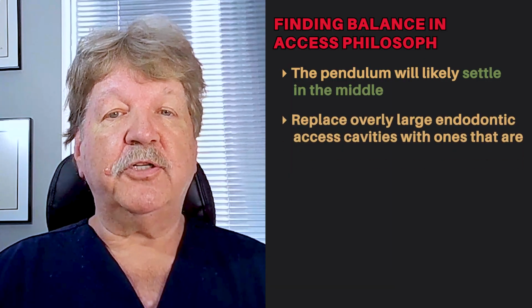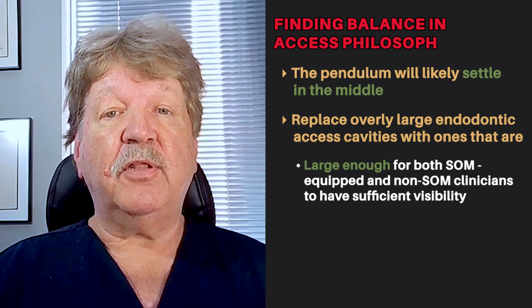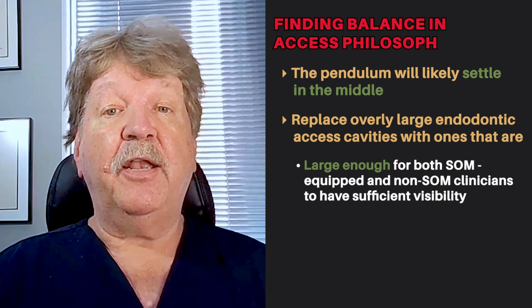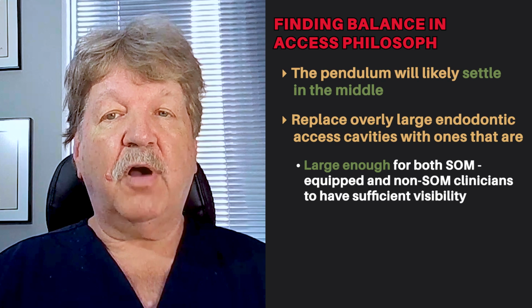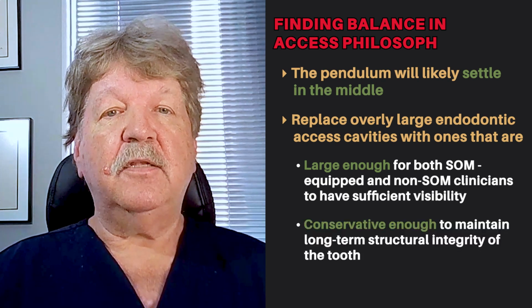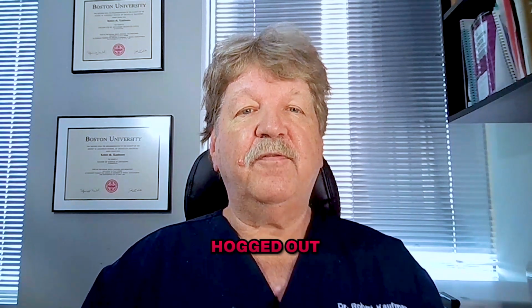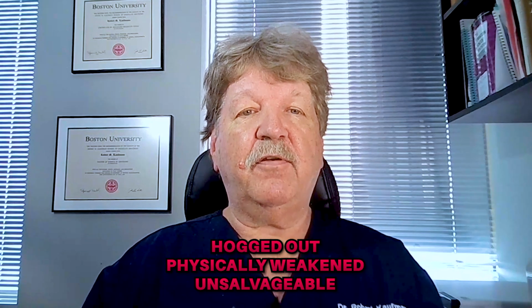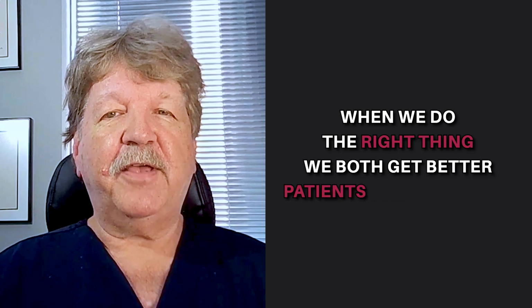Hopefully, the overly large endodontic accesses of the past will be replaced by accesses that are large enough to allow both the surgical operating microscope and non-surgical operating microscope equipped clinicians sufficient visibility to properly perform predictable endodontic treatment, while at the same time respecting the need to conserve tooth structure that allows for better long-term structural integrity of the tooth. As always, case assessment prior to starting the treatment is better than referring a hogged-out, physically weakened, unsalvageable case to your endodontist. Remember, when we do the right thing, we both get better, patients and clinicians.